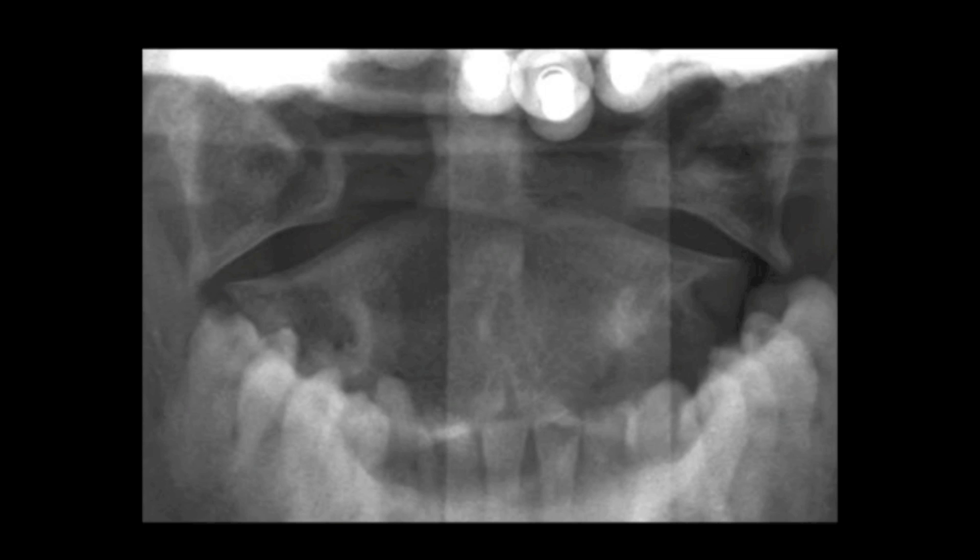On the peg view we see that both of the lateral masses of C1 are displaced laterally relative to the lateral masses of C2. You can see that with my laser pointer — C1 is overhanging C2. It should normally be a straight line like this, but you can see that both sides have displaced laterally.